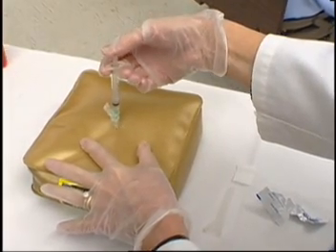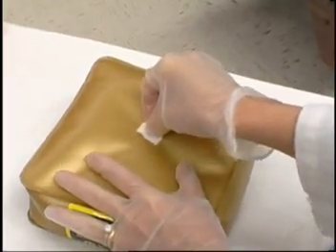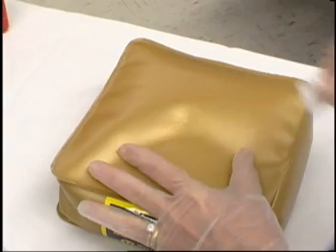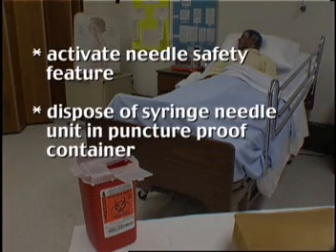Withdraw needle quickly and massage area with an alcohol wipe. Activate needle safety feature. Dispose of syringe needle unit in puncture proof container.